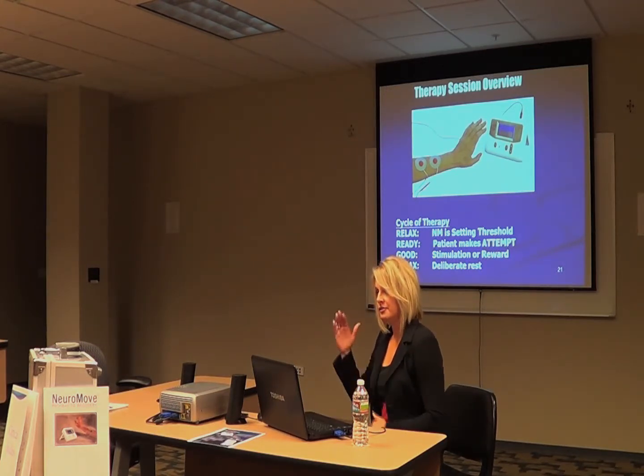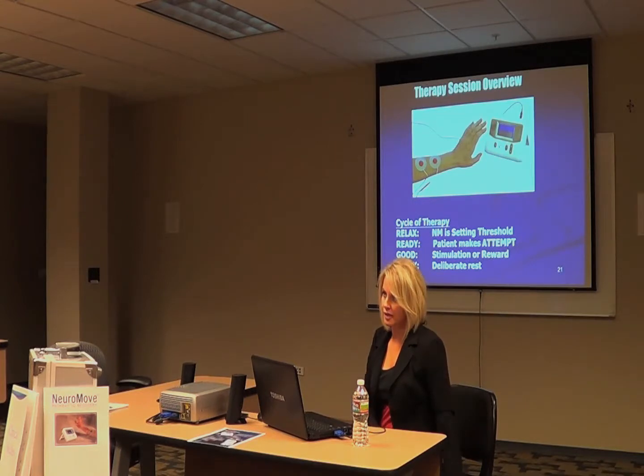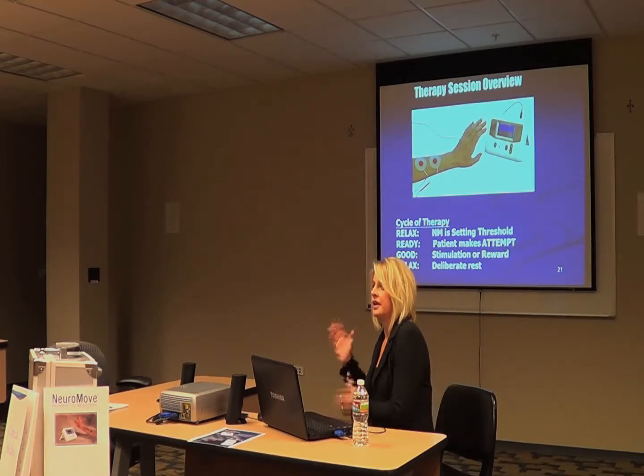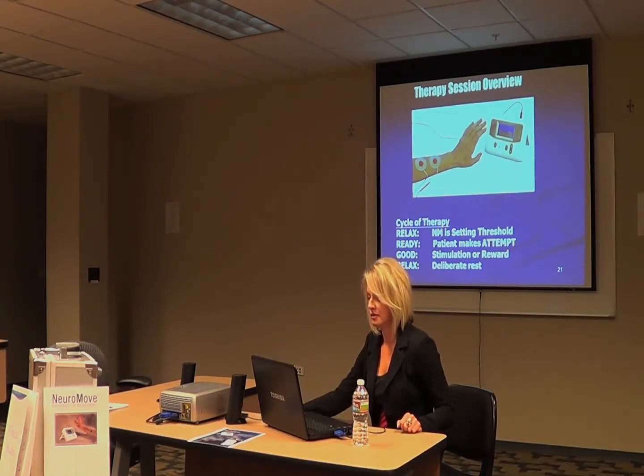And the difference between the rest and the attempt should be very vast. It's important to have really good relaxation and really active imagination. Those differences are really going to lock in that rewiring process.